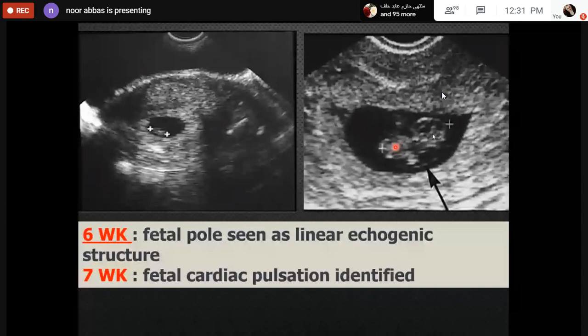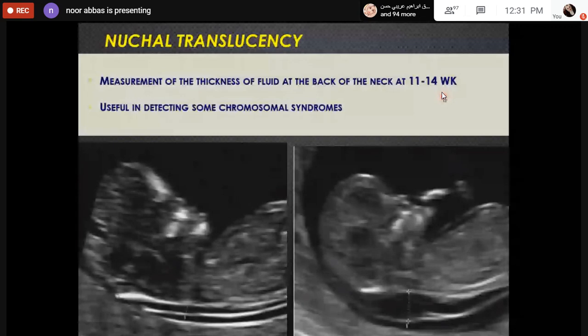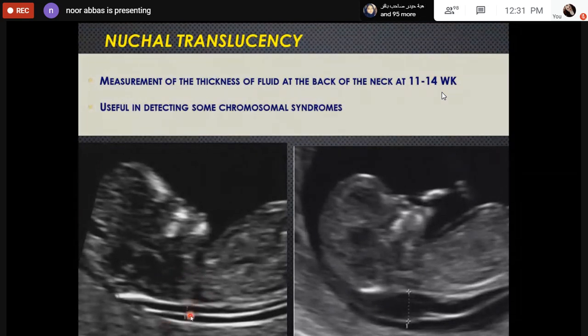Ultrasound in the first trimester is also used for assessment of nuchal translucency. Nuchal translucency is a space موجود in the back of the fetal head. هذا space يسوي له measurement 11 to 14 weeks as part of aneuploidy screen. Aneuploidy and chromosomal abnormalities اللي يصير especially Down وغيره اللي يصير مثلاً اللي أكو risk factor مثلاً previous baby with Down أو strong family history of Down أو مثلاً old parents اللي عندهم risk of chromosomal فسوي لهم هذا nuchal translucency test اللي هو نقيس الفلويد in the back of the fetal neck وهذا عادة يكون أقل من 3 millimeters لكن إذا هو large it indicates a high risk of aneuploidy بالأخص كروموسوم يعني Down.